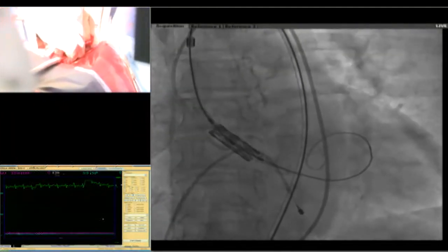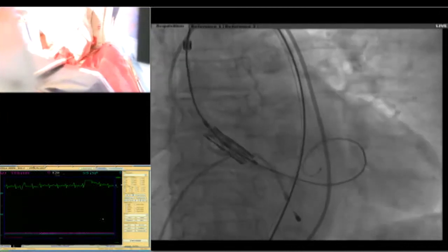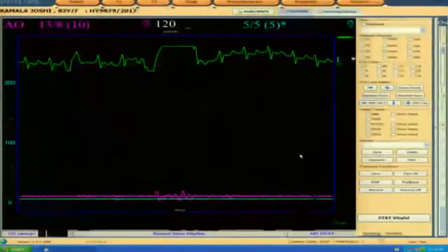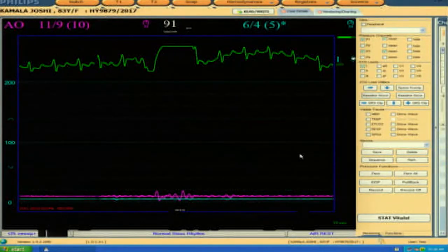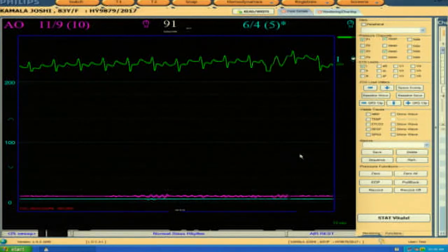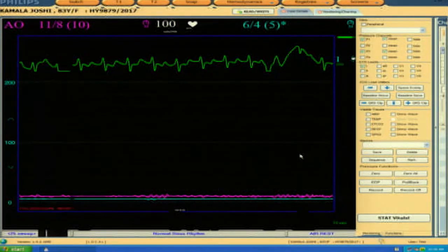Do you have pressures on the screen, please? How much is the pressure? Please tell the pressure. Right, so let us go in a little here. So I think we'll take a picture here. Let's go in. Okay, you're ready with the picture? Cine. Inject.